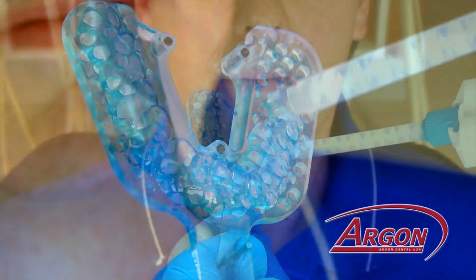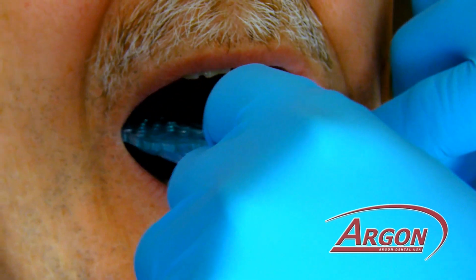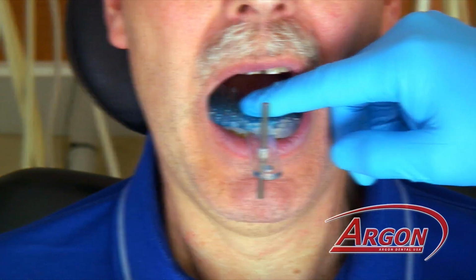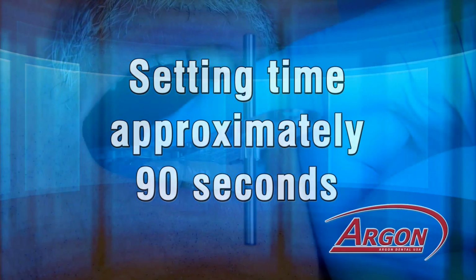Apply the bite registration material to the scan solutions guide, put it on the arch that you are going to take the scan on, and allow the material to set. This is a 90-second material. If you use any other clear bite registration, please check the setting times.